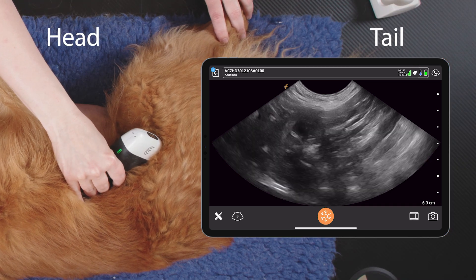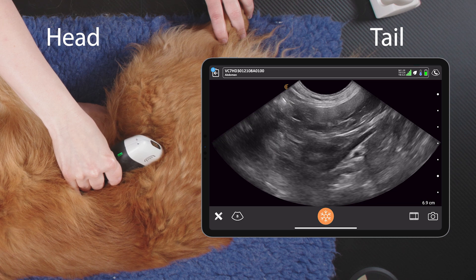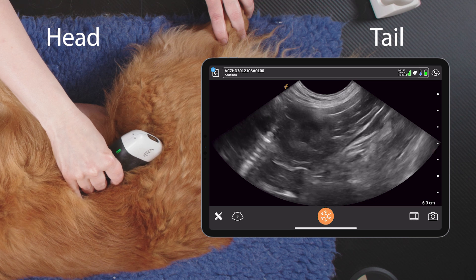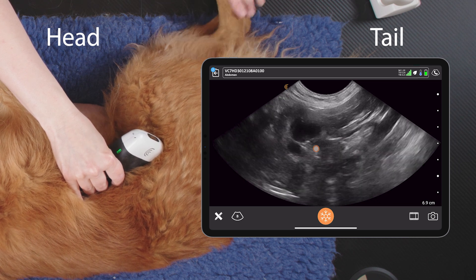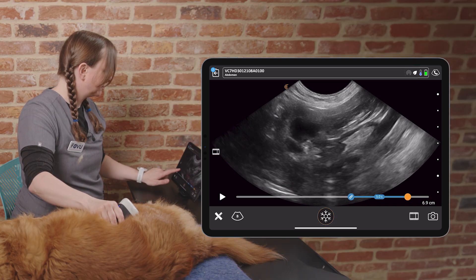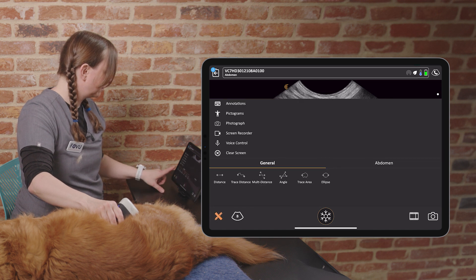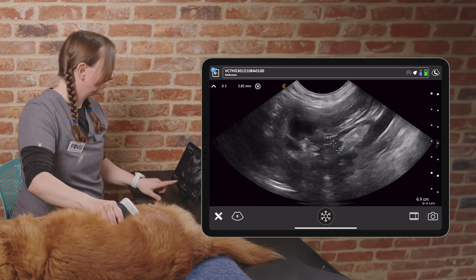There's our left renal artery, and as we fan through, our right adrenal will pop into view just there. And we can take that caudal pole measurement. That's how to scan the right adrenal in a dog. Moving on.